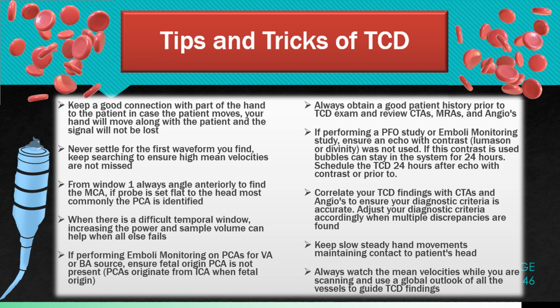Lastly, we'll review some tips and tricks of TCD. These are just some things to keep in mind. It's always good to have a good connection with your hand on the probe and the patient's head. So a lot of times I'll have my pinky on the patient's head, touching the head itself, so that I have a firm grasp on the side of the patient's head. So when they move their head, my hand is moving along with their head, and I'm able to stay on the vessel, and I won't lose the vessel with patient movement.